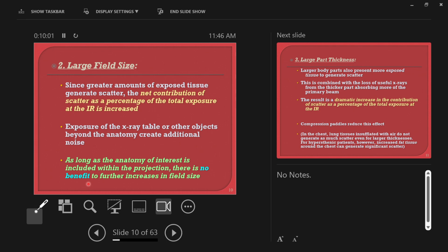You have to be less than 0.8 of an inch at 40 inches, and less than 1.44 inches at 72 inches of SID. If your SID were bigger or smaller, that number would change. They only test at one SID, they test at 40. So if you're aligned at 40, then you're aligned at 72.